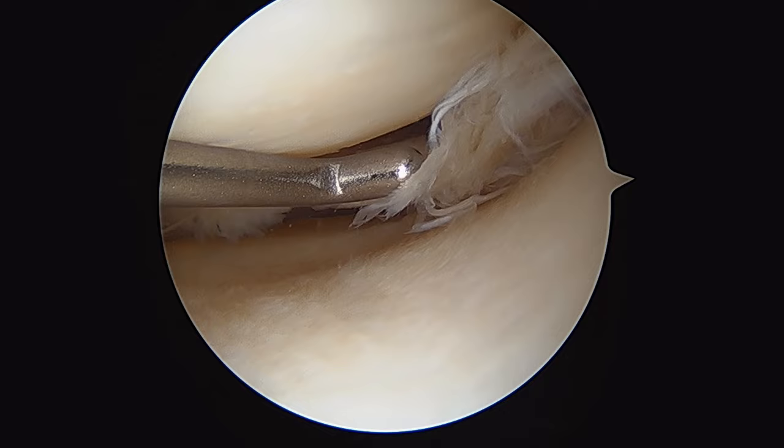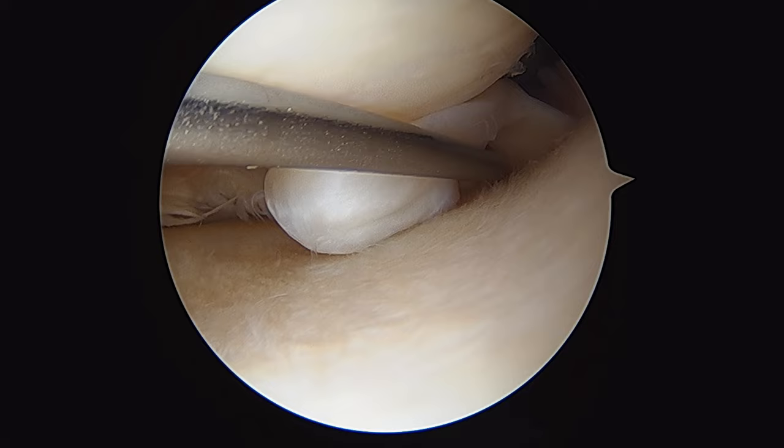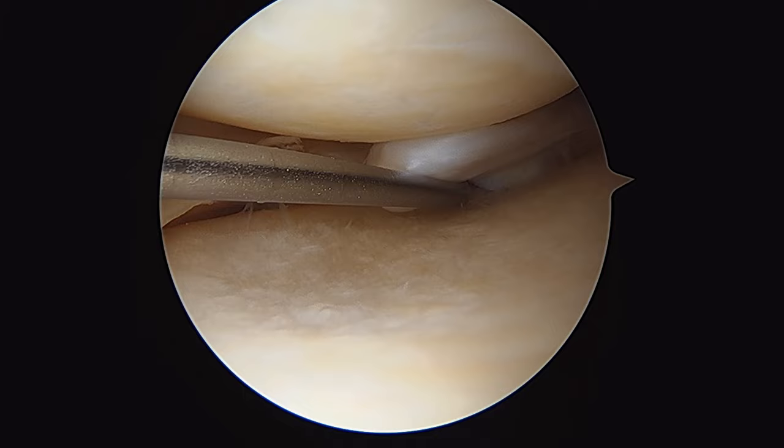The tear extends around from the body into the posterior horn of the medial meniscus, and here you can see this large flap of unstable meniscal tissue just adjacent to the posterior root of the medial meniscus, and that's a clear source of this patient's symptomatology.